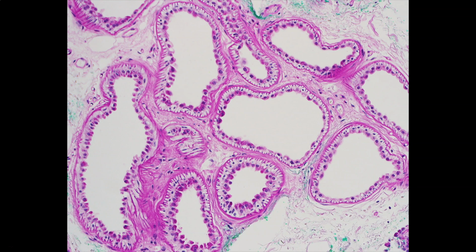And here, this is just for the sake of pure beauty. This is a PAS stain, periodic acid-Schiff stain. We usually use this to look for fungus or occasionally for certain types of other inclusions and depositions. Here, this was just, I think, control tissue that happened to have a beautiful apocrine gland, and I was blown away by how amazing apocrine glands look when you stain them with PAS. With diastase, which dissolves away glycogen and the sugar molecules, but leaves behind other substances.